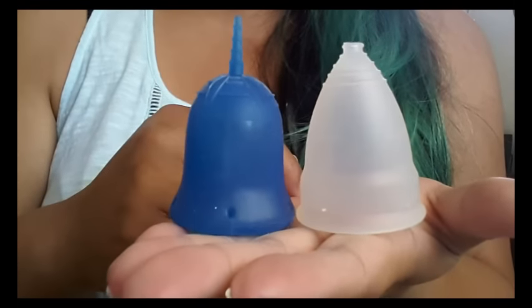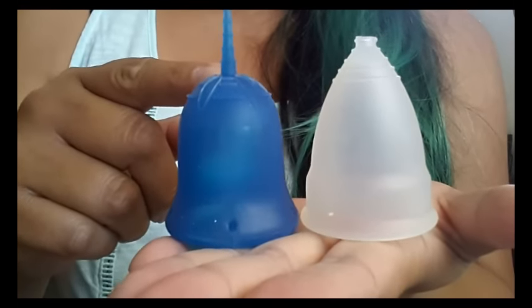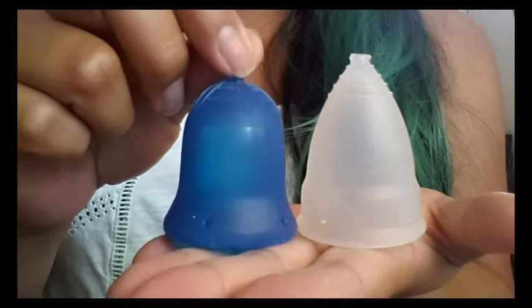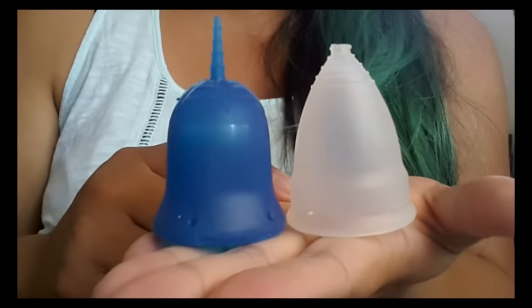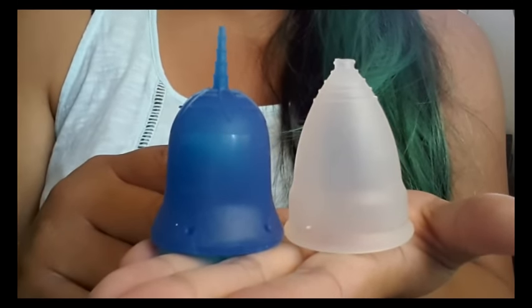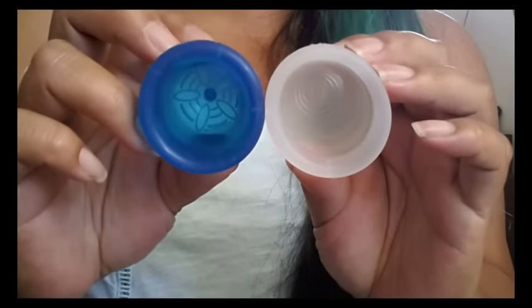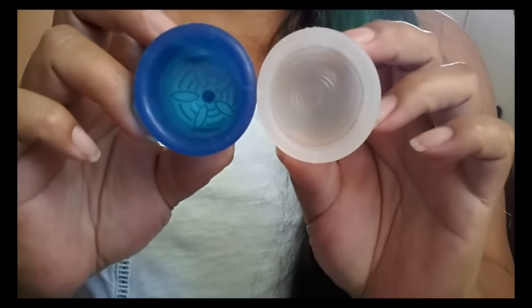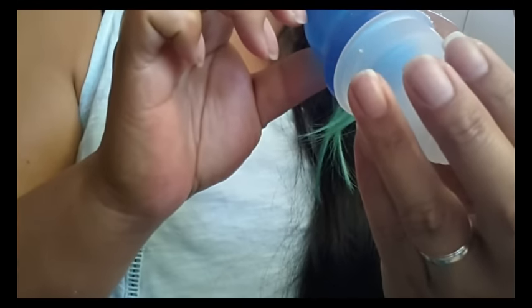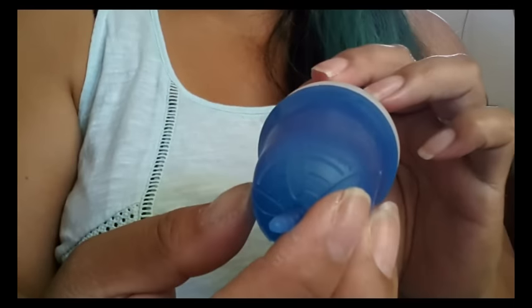Here's my Diva Cup — this is a size 2, the larger size. You can see that the Scoon Cup is quite a bit shorter. The Diva Cup is V-shaped and the Scoon Cup is a bell shape. Because it's a bell shape, it's really good for somebody with a low cervix. I have a high cervix and maybe that's why it rode up on me a little bit. They hold the same amount of capacity — the rims are pretty even when you put them together.